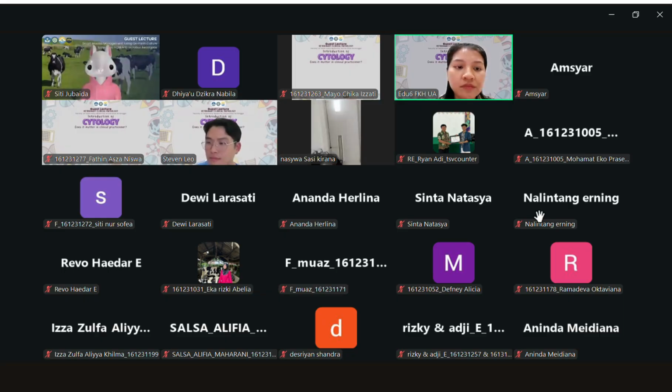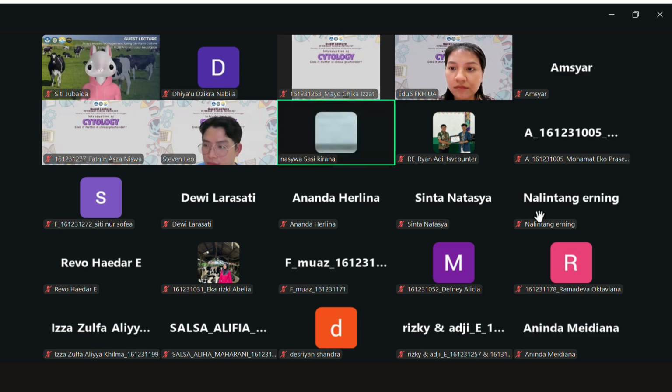So I'm actually still very confused about how to know the difference between melanoma and mast cell tumor, because there's a preparat that I talked about first, it was about a mast cell tumor, and Dr. Stephen thought it was melanoma.